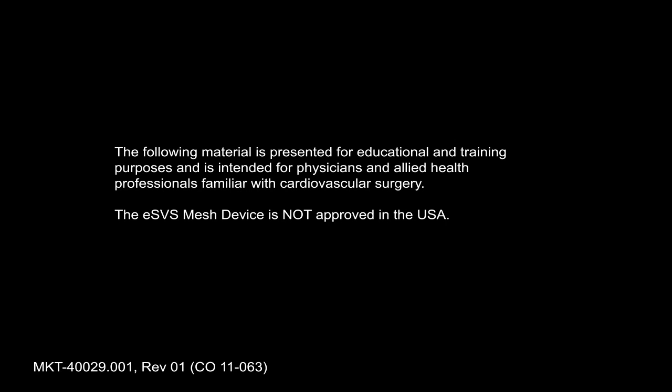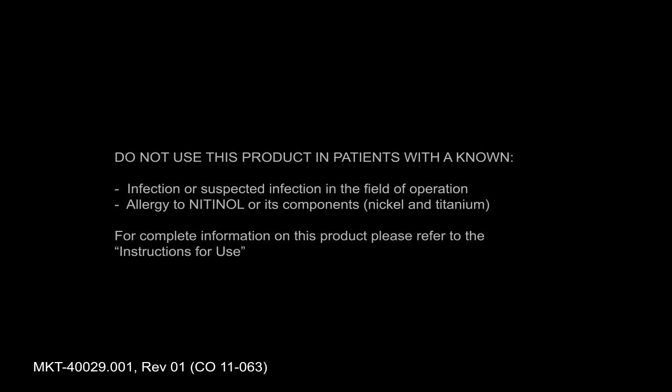The following material is presented for educational and training purposes and is intended for physicians and allied health professionals familiar with cardiovascular surgery. The ESVS mesh device is not approved in the USA. The ESVS mesh is indicated for maintaining saphenous vein bypass graft patency in patients undergoing coronary artery bypass procedures utilizing autologous saphenous vein grafts with external diameters from 3.6 millimeters to 7.0 millimeters and double wall thicknesses less than 1.4 millimeters. Do not use this product in patients with a known infection or suspected infection in the field of operation or allergy to nitinol or its components nickel and titanium. For complete information on this product please refer to the instructions for use.